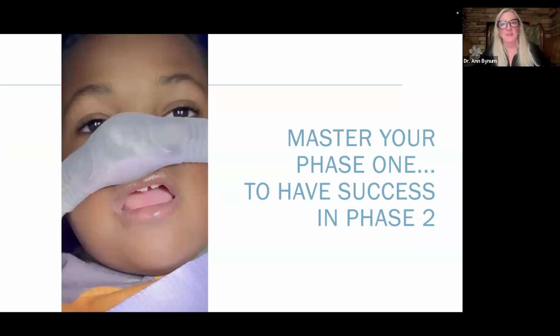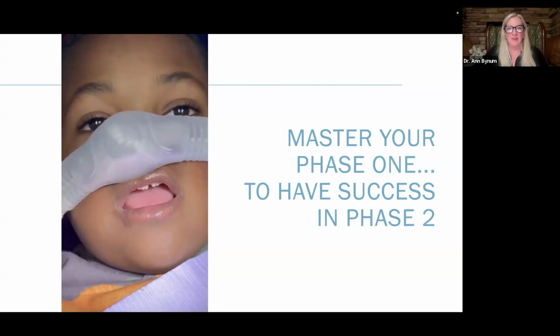If you lose the patient during this part of the injection, that's what I'm trying to say. The goal is not to lose the patient during this part of the injection. If you lose them here, you are going to really struggle to gain their trust back to give that stage 2 and then start your treatment. So getting this part right is very important. Josh and I have been using these devices for over 2 years now. So I'm not using topical anymore. To me, that's an extra step. It's gross. It's in their throat. I don't use topical. I feel like I have mastered this and I can go straight in with stage 1 without needing any topical and have success most of the time. So getting that right is very important.